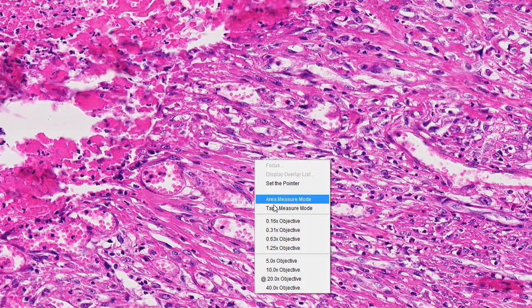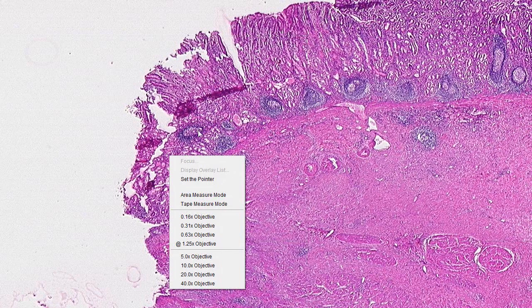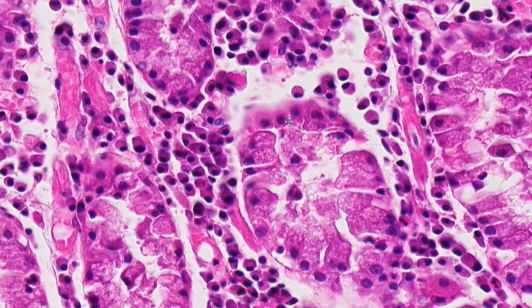So most likely this patient's ulcer is caused by one of the common causes, either going to be H. pylori or chemicals. I can tell you that these lymphoid aggregates are suggestive of H. pylori. They're not pathognomonic. We'd actually want to see the organism to diagnose the H. pylori, so we can sometimes look for them on H&E. And the H. pylori organisms typically live just on top of the epithelial cells here. If you look for a gland, inside a gland, maybe here is one, they typically look like little seagull-shaped organisms, and they live in the mucin just on top of the epithelium.